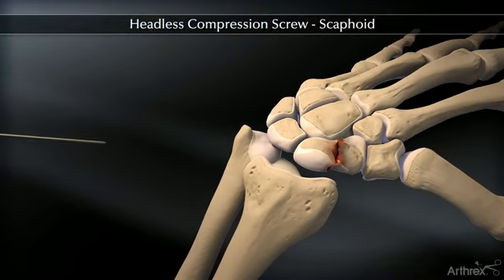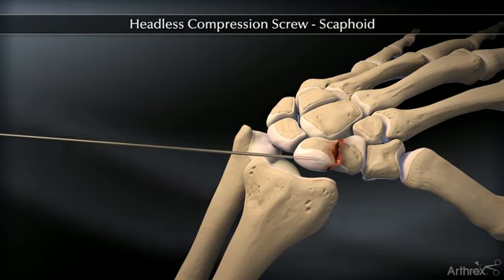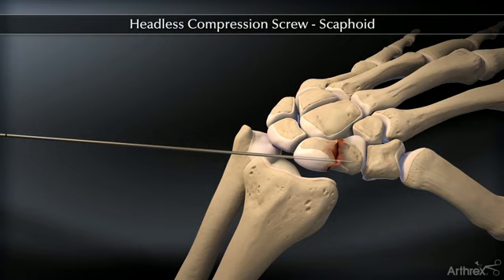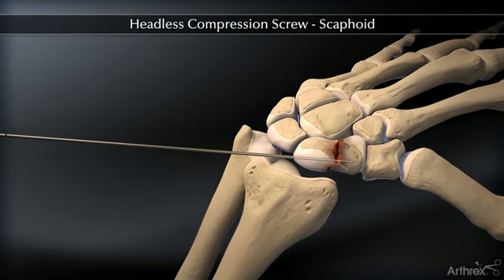Having established the entry point, introduce the appropriate guide wire aiming for the base of the thumb and check the position on the fluoroscope. Confirm the wire placement and depth under imaging.